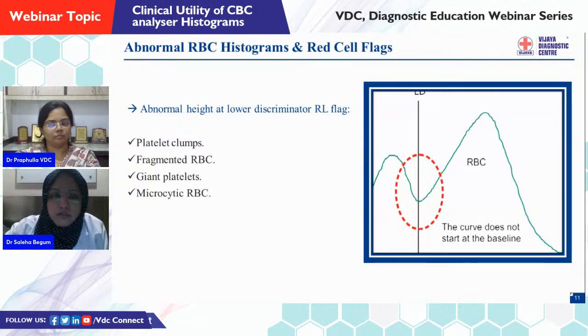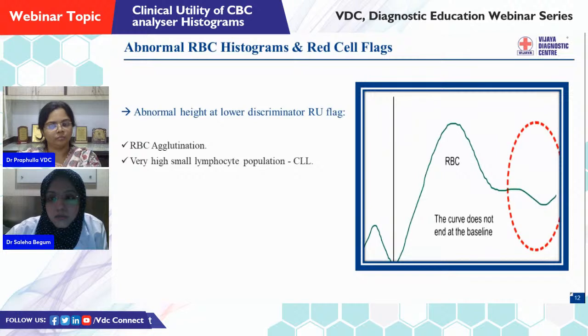So those particles, when present in significant number, interfere with the lower discriminator, and the machine is unable to decide where to keep the lower discriminator. Hence the graph starts abruptly. So the causes will be platelet clumping, fragmented RBC, giant platelets, or microplatelets. So this is one variation in the RBC graph from the normal. Let us see the second variation.